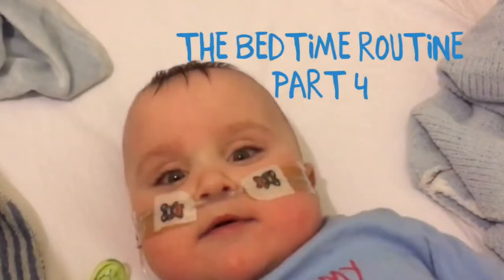So here we are with the final part of our bedtime series. This one's the connection phase, and as usual everything that you see is done in conjunction with the training we receive from Baxter and also Great Ormond Street. So another two minute hand wash, some more gel, and now we're going to connect the bags up.